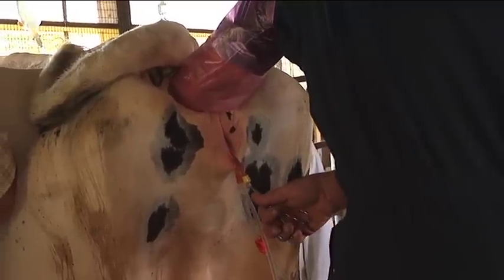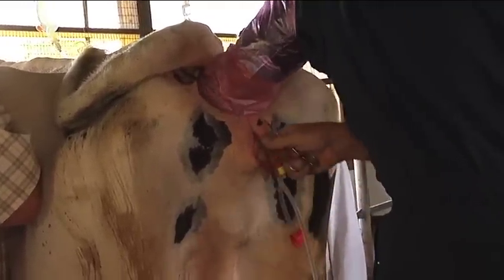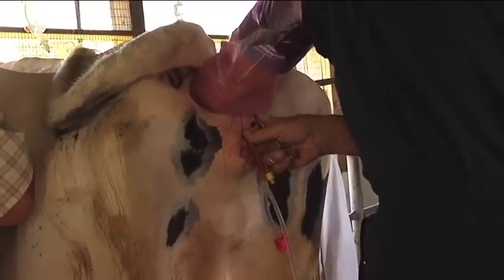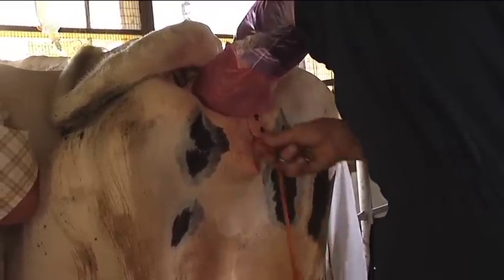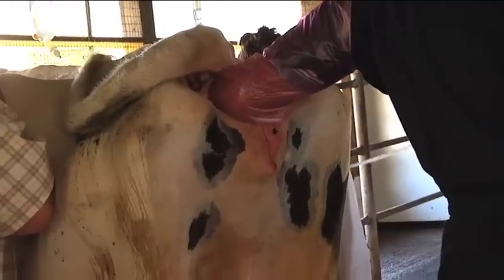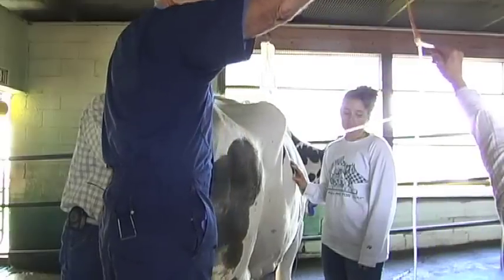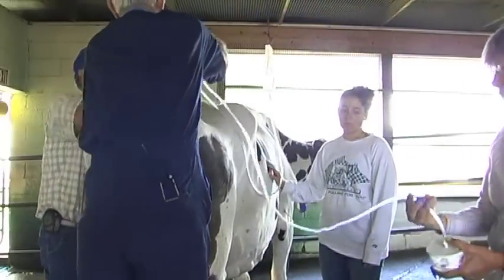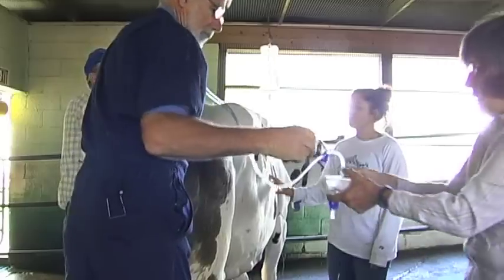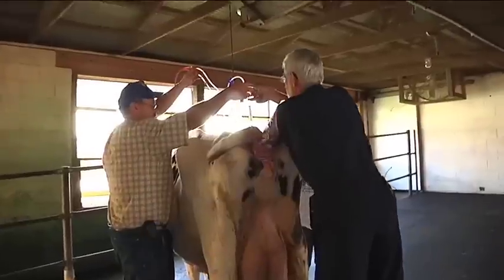Now that the uterus is empty, the cuff is deflated and the catheter is removed. The hose and catheter are rinsed out. After the first horn has been flushed, the process is repeated for the second horn.